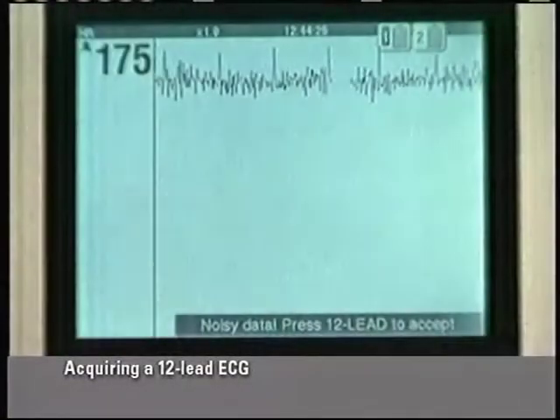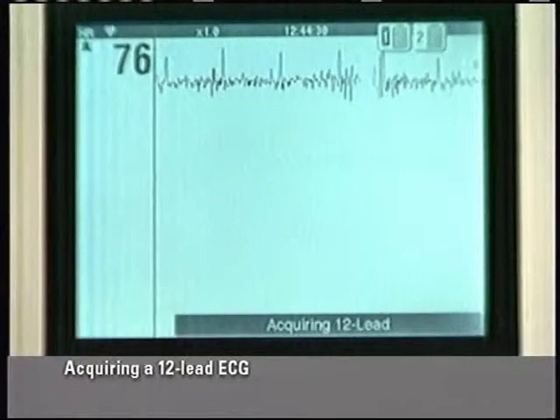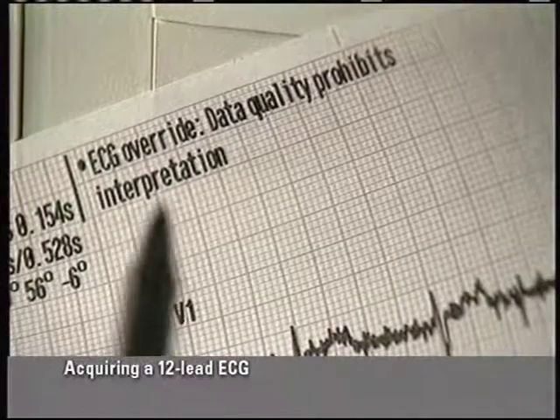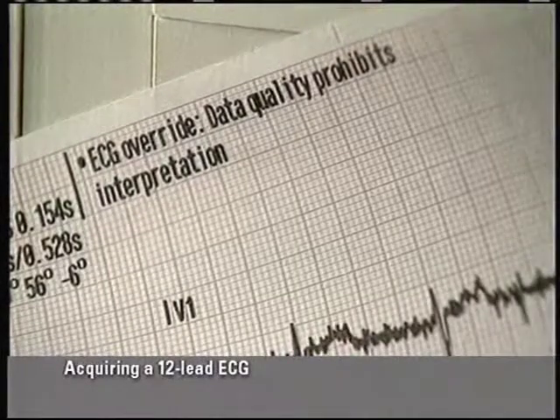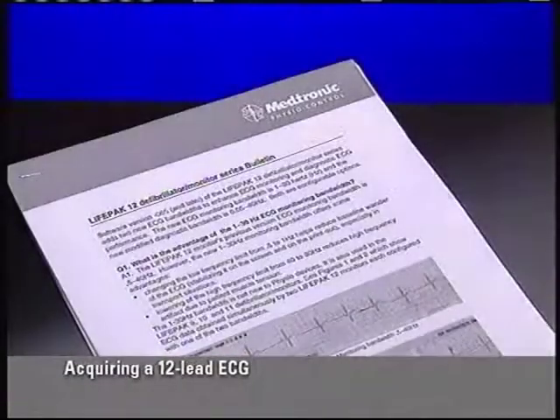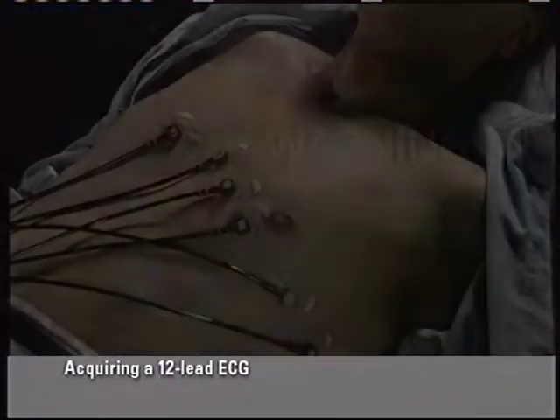If you are unable to clear the noisy data message, press 12 lead a second time. This forces the monitor to acquire the data in spite of a noisy signal. Any 12-lead ECG reports acquired in this way are annotated with the message "ECG override, data quality prohibits interpretation." For more information about troubleshooting ECG noise, request a copy of the LifePak 12 Bulletin about ECG bandwidths and ECG troubleshooting.